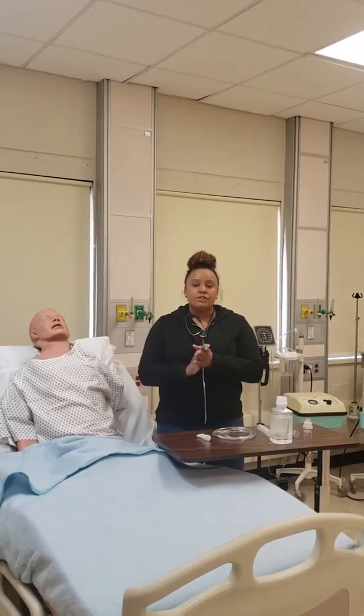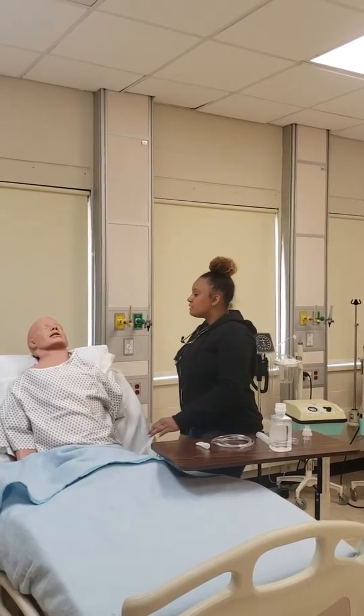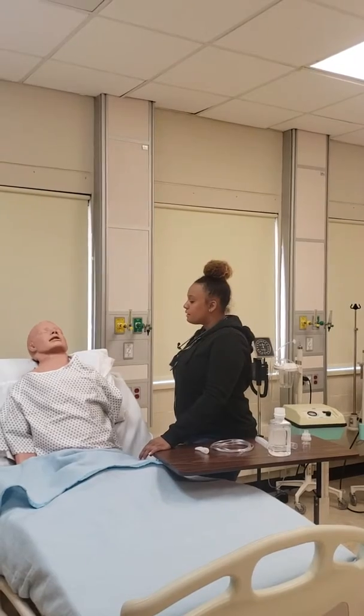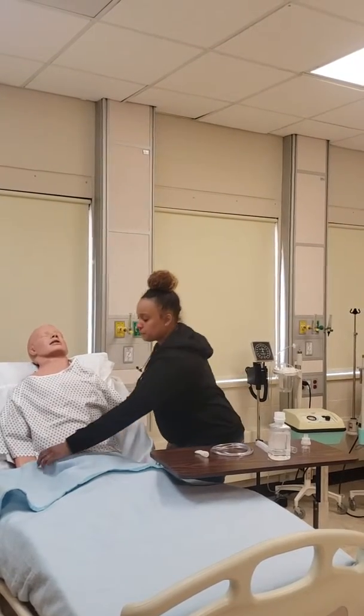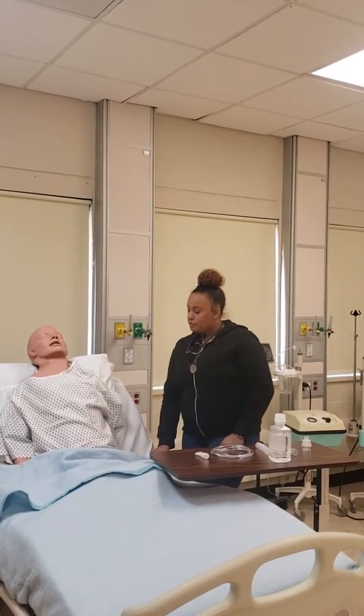I will now wash my hands for at least 15 seconds and apply gloves. Hi, my name is Tanika. I'm from Respiratory Care. May I please have your name and date of birth? Okay. Well, I'm here to give you a breather treatment today, okay?